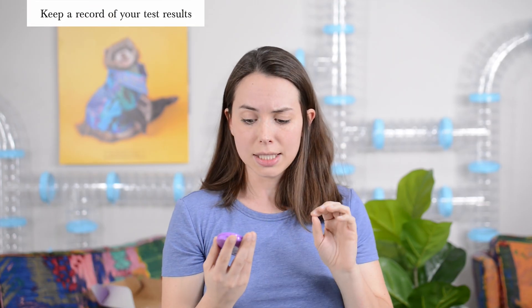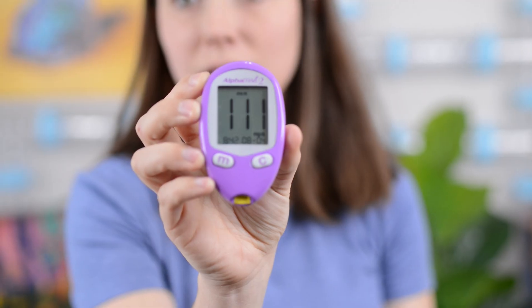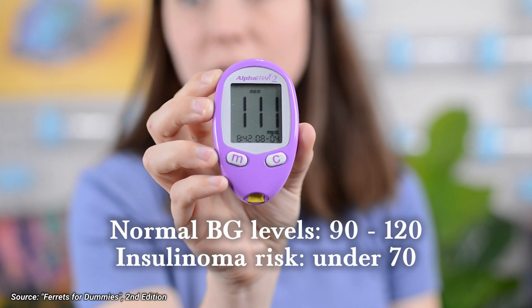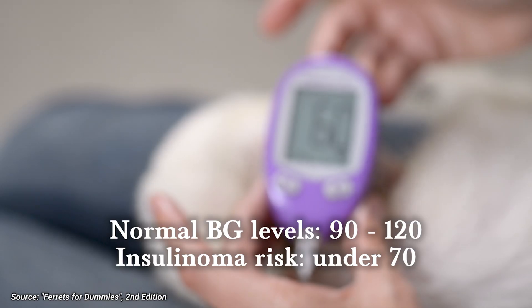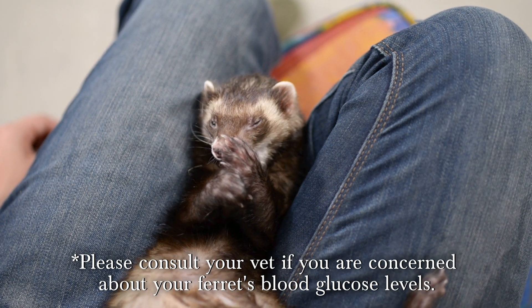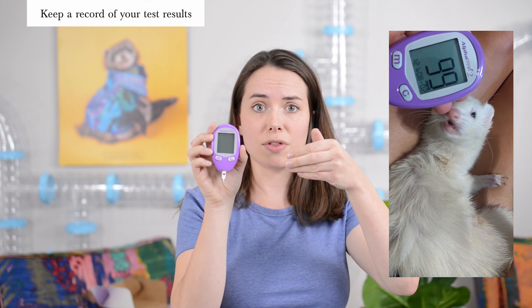Once you get the blood sample, the monitor will beep when it's gotten enough and then show a loading symbol while it calculates the reading. Once you get the number, record it somewhere. According to Ferrets for Dummies, a normal blood glucose reading is between 90 and 120. Your ferret may be at risk for insulinoma if their reading is 70 or below — consult your vet if you have any concerns. The monitor does record readings internally, but we also take a photo of the monitor with the ferret next to it so we remember which ferret the reading was for. Take notes: was your ferret fasting, how old are they, are they on medication, and did they have any other symptoms?